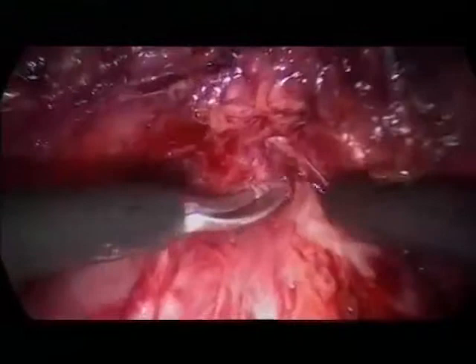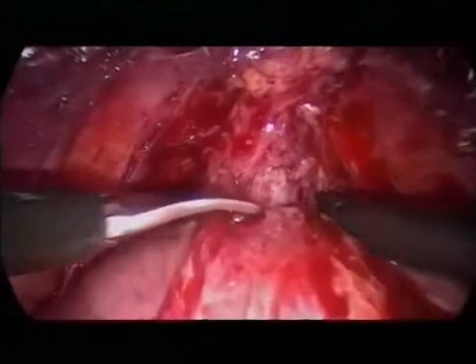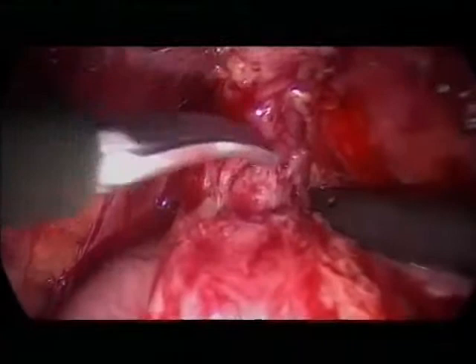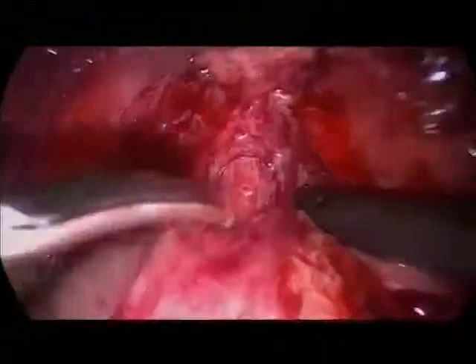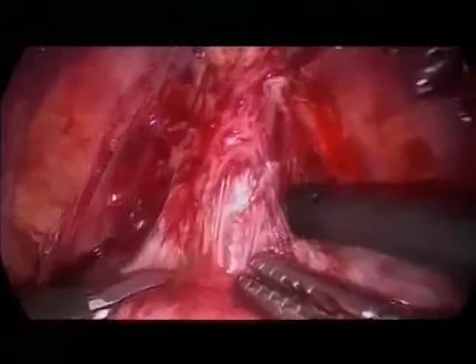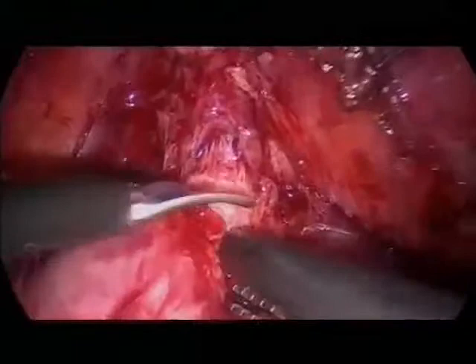So this is the second step. And the third step is the mobilization of the smooth muscular part, which is this. Can you see that? Go back a little bit. This is the first step, Santorini plexus. Very nice. This is the second step, the external sphincter, striated part. And this is the inner layer of the urethra, the smooth muscular part of the urethra. We mobilize this, and we push it down a little bit, and then we cut. It's very nice to see the three steps of the apical dissection ventrally. So now we cut down, and we see immediately the catheter.